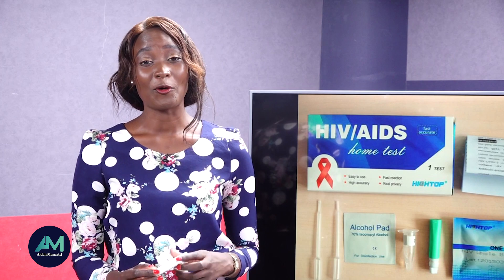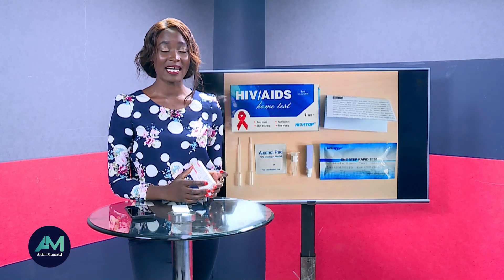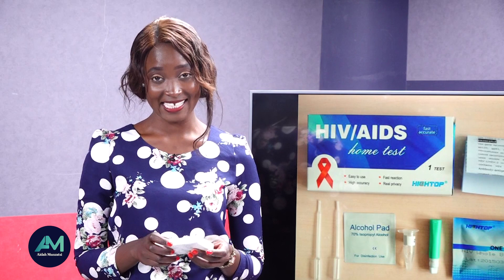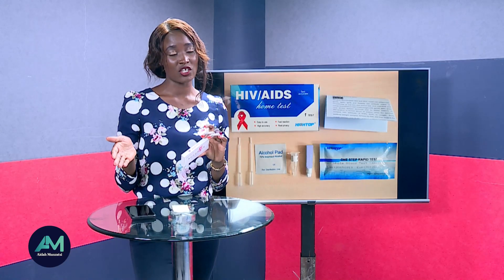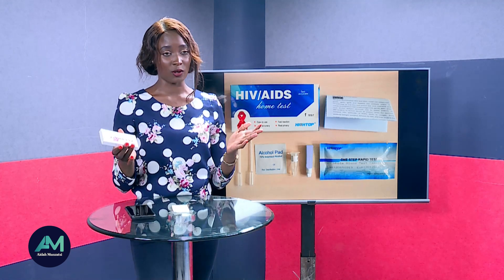Hi, thank you for joining and learning together with me on how to do a self HIV test at home. My name is Aida Muzati. First, this kit — you can get it from a pharmacy. If you're in Kenya, it costs between 200 to 300 shillings, that's about $2 to $3.